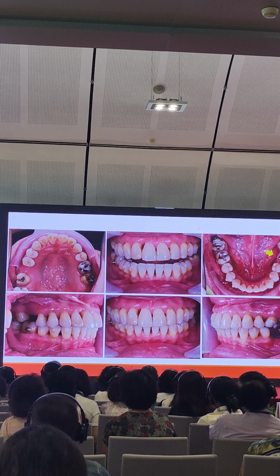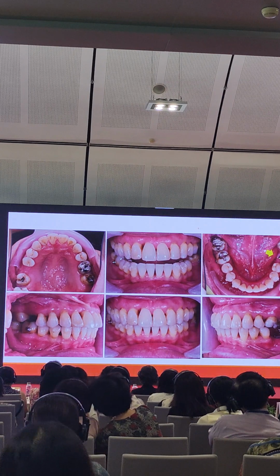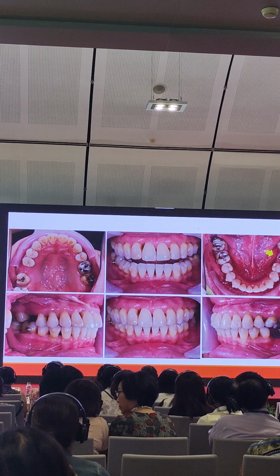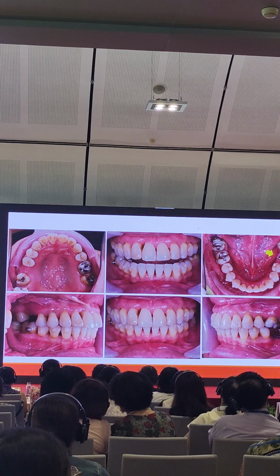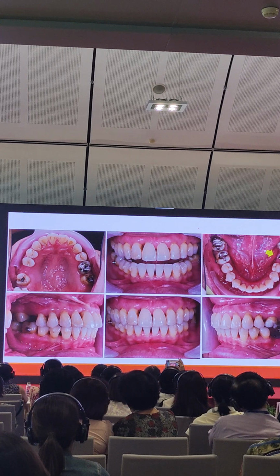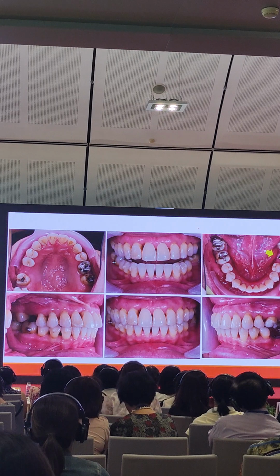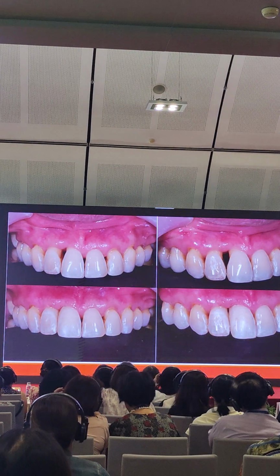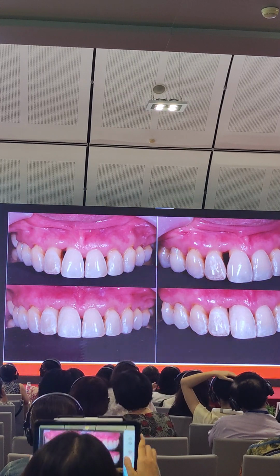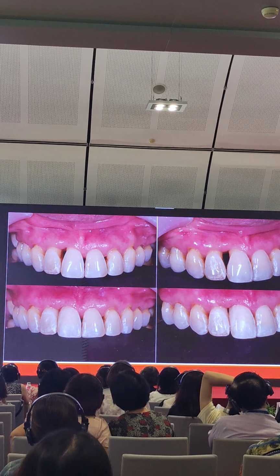But when we look at the initial treatment, now the patient looks much better aligned, and the black triangle is still here. Since then, the periodontal situation has been controlled quite well, and you can see I already inserted an implant on the 3/6, because the space is already available. The patient has some concern about the black triangle, so I use some composite to reduce it.